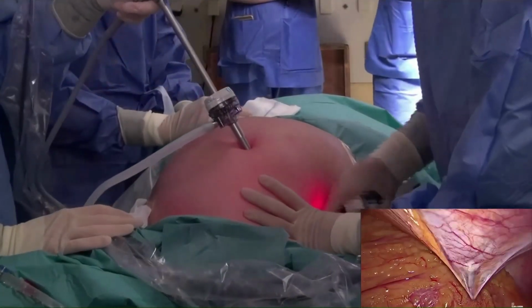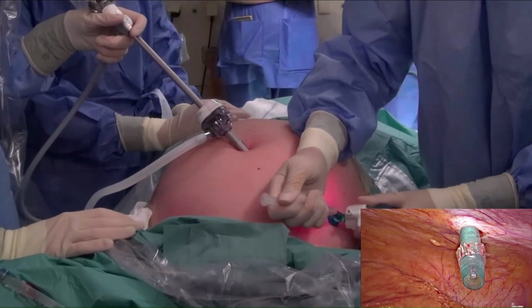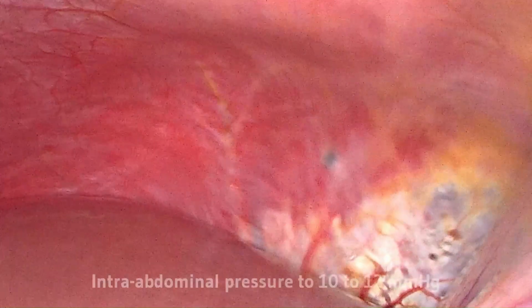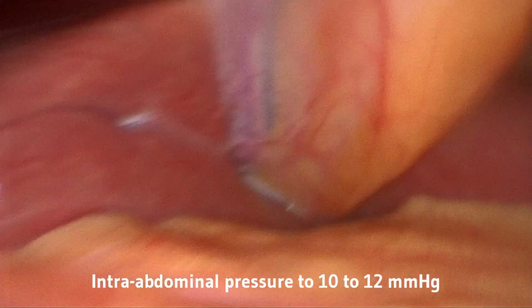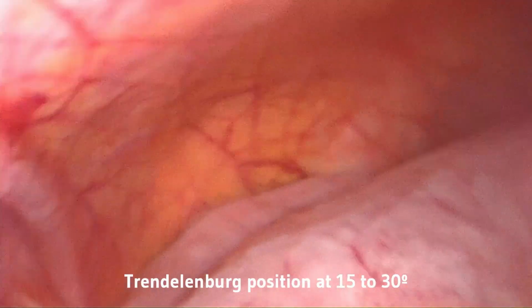We insert a single accessory trocar of 5 mm into the left or right iliac fossa to minimize the risk of blood contamination of the samples. We inspect the abdominal cavity and then reduce the intra-abdominal pressure to 10 to 12 millimeters of mercury and position the patient in the Trendelenburg position at 15 to 30 degrees, which is maintained during sample collection.